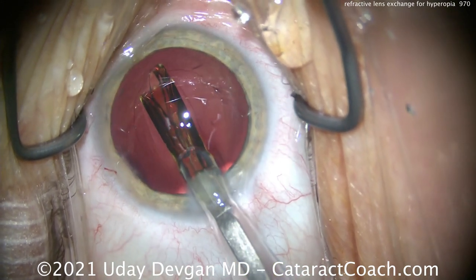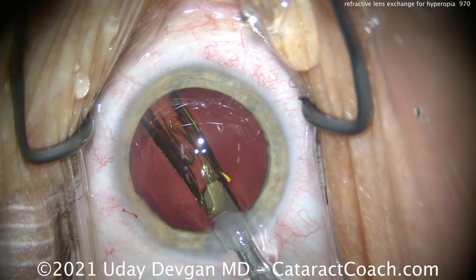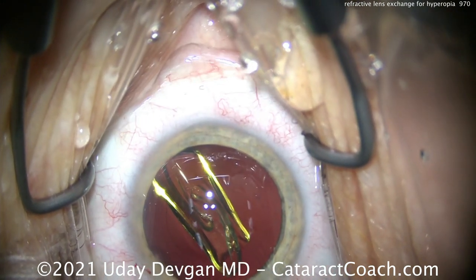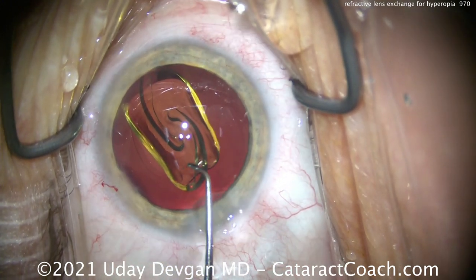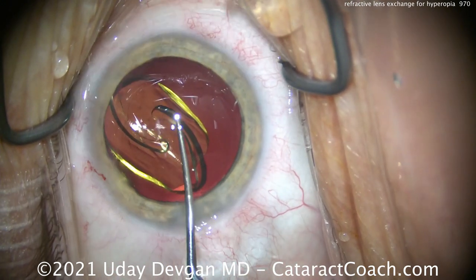Here's the 34-diopter lens — this is an Alcon PanOptix lens, a trifocal lens, and this is going to give the patient a full range of great acuity without having to wear glasses.